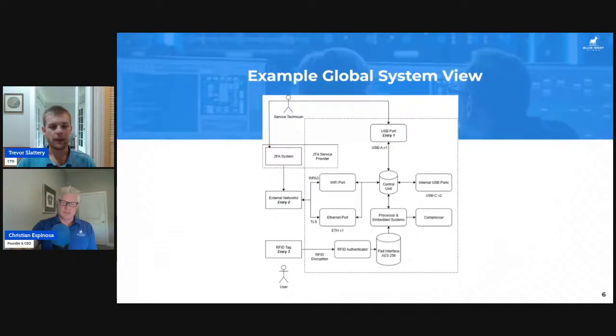If you are blending your architecture views and your threat modeling, we do recommend that you adhere to the DFD3 standard to be compliant with the MITRE playbook for threat modeling medical devices. That's the data flow diagram version 3 standard. Yes. And what we're capturing here is anything physical as far as the entry points, USB points, JTAG interfaces, things like that, as well as any internal components.